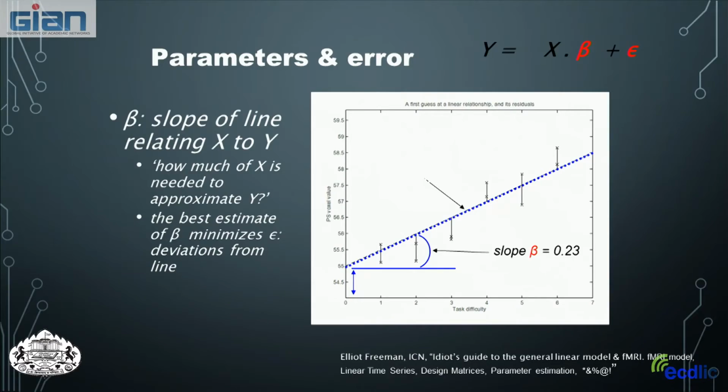So if it's a steeper slope, then our signal is changing more with the data. And really it depends on the model and the fit, okay? So how well does our model fit our data in a linear way? And again, these little deviations from the line are what make our error terms.